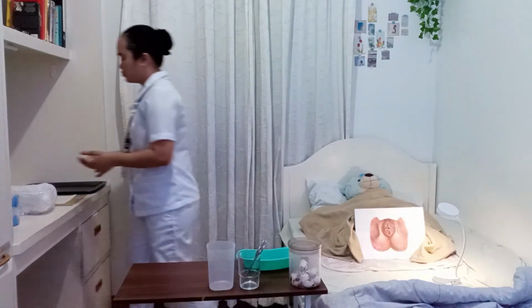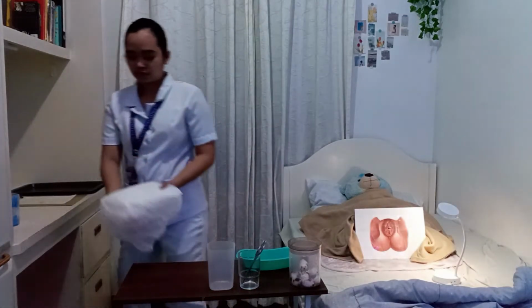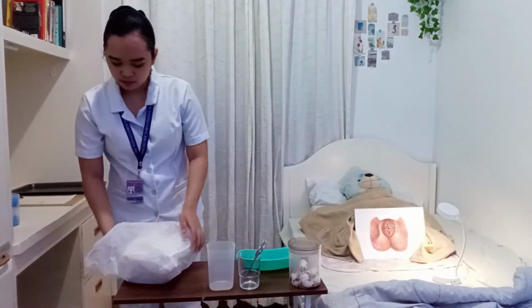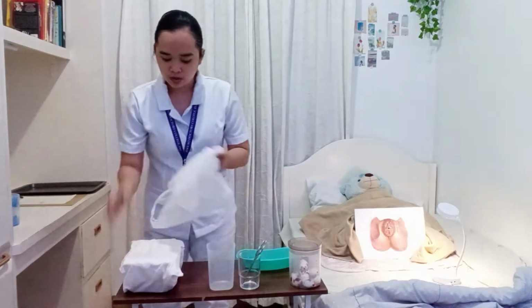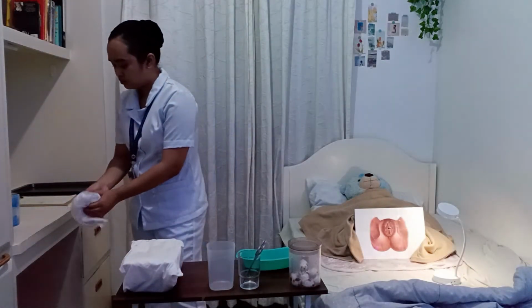So now we're going to open the set and arrange the equipment for convenience and accordingly to avoid contaminating the materials. So this is done to increase the speed of performance, and also since reaching over sterile items will increase the risk of contamination. Okay, I'm going to discard this one.